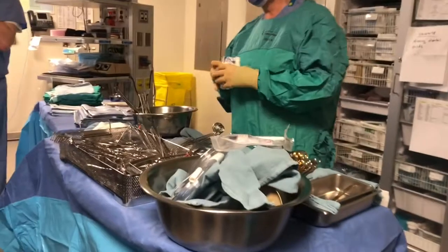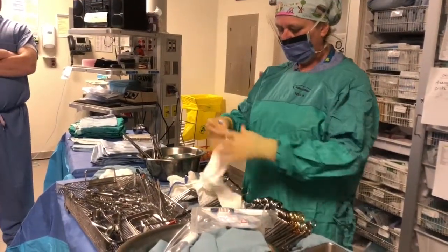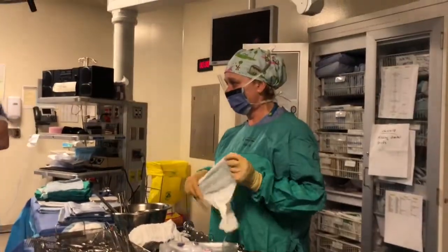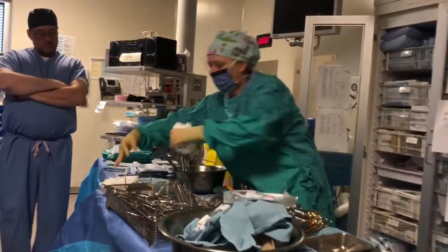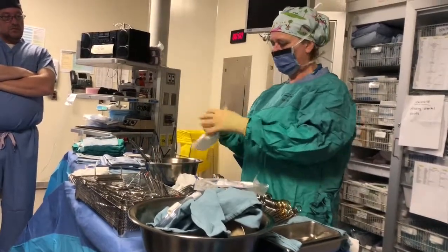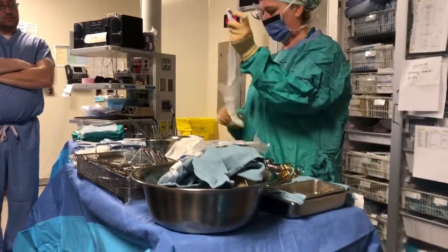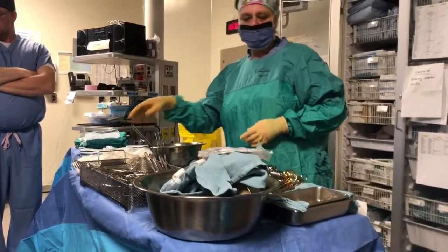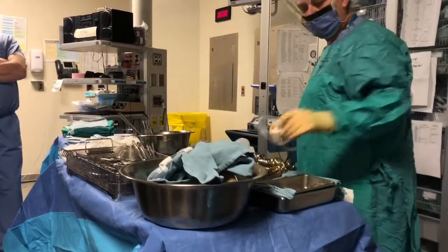So basically, we're gonna count large bunches. I'm gonna go 1, 2, 3, 4, 5, and then you're gonna write 5 in that very first block. Then I'm going to count it back. 1, 2, 3, 4, and 5. So there's 1. Then I'm going to do the other one. 1, 2, 3, 4, and 5. Then 1, 2, 3, 4, and 5. So you're going to put 5 beside it. And then you're going to move down.